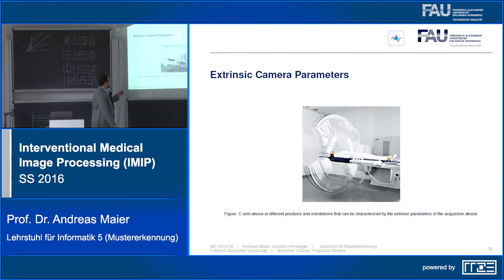And now imagine, this is a clean showroom, so this is not how it looks in an interventional room. An interventional room is full of stuff. So now imagine there's your nice anesthesia machine that is typically located here, and somebody pushed it just 10 centimeters too close, and this rotates with 50 degrees per second. And you make this pretty heavy. What will happen is it will hit the anesthesia machine, and if you're not able to decelerate very quickly, then it might push it against somebody. Or imagine a person standing there. The heavier your C-arm is, the more harm you can do to the person.